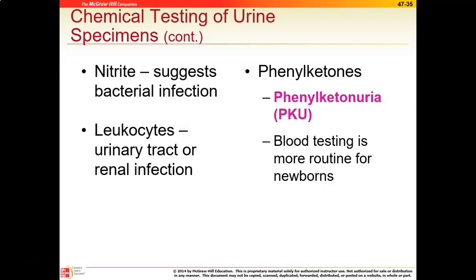And then we have something called a nitrite. And a nitrite is a byproduct of bacterial invasion or infection. So we only see nitrites if bacteria have actually colonized within the urinary bladder. And so nitrite is what we call pathognomonic or indicative of an infection. So if somebody's got nitrites and leukocytes, they almost inevitably are given antibiotics, and then a culture is sent to make sure that the appropriate antibiotic has been given. Okay, we don't see nitrites unless there's bacterial infection.